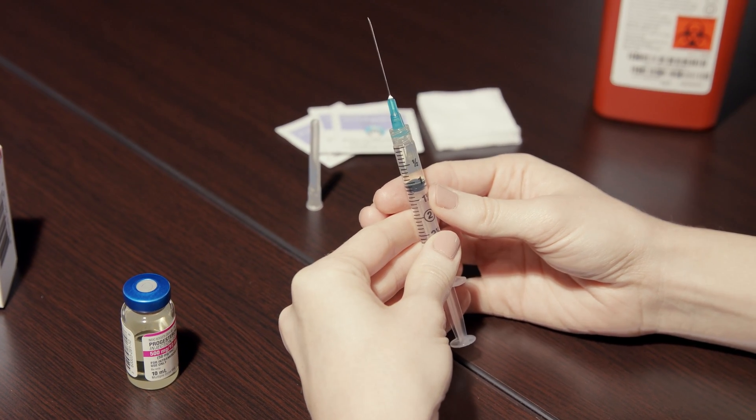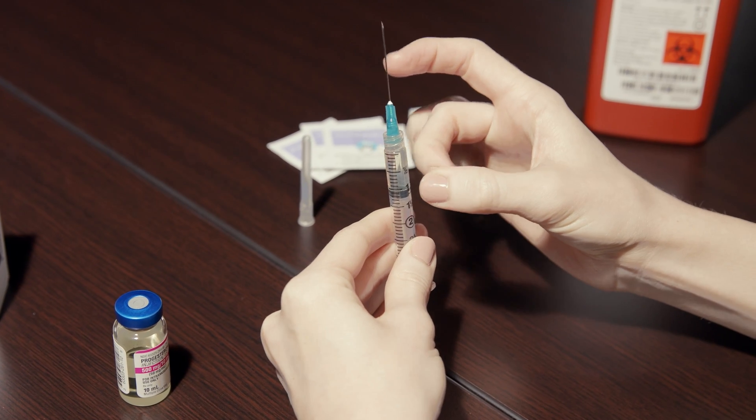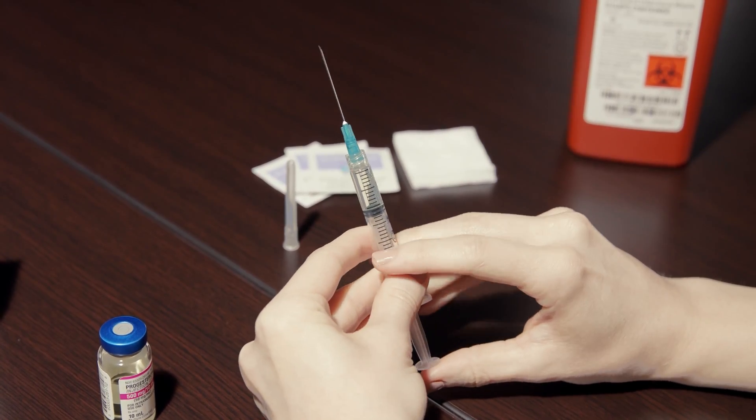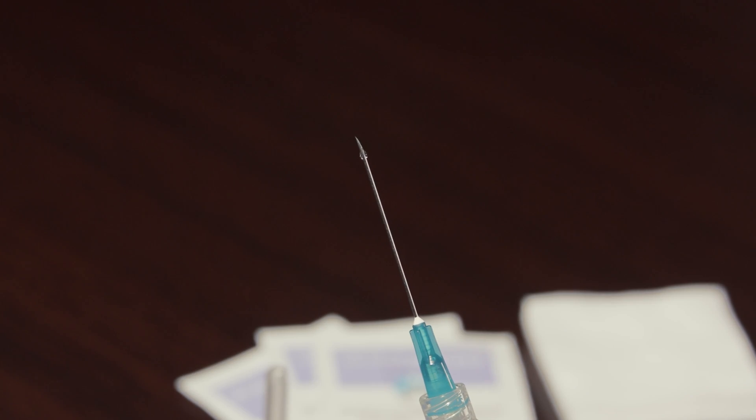Still holding the needle upright, gently tap the side of the syringe until the air bubbles migrate to the top. Put pressure on the plunger until a drop of liquid appears at the tip of the needle.